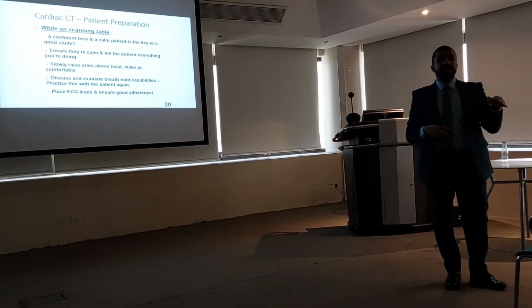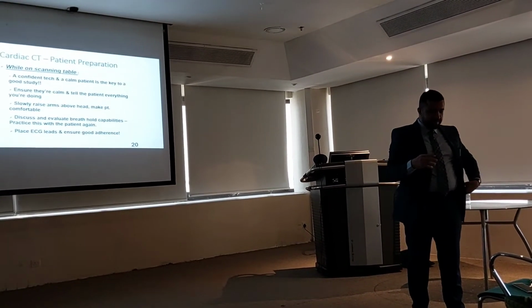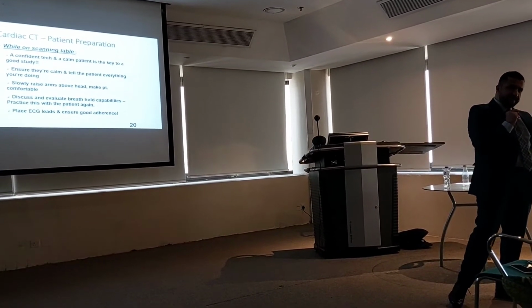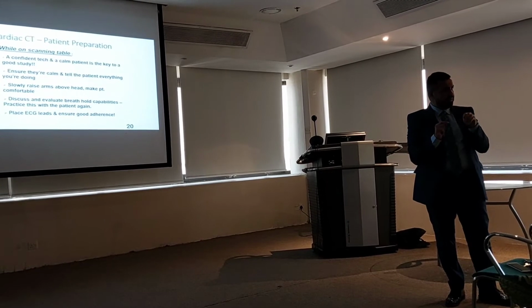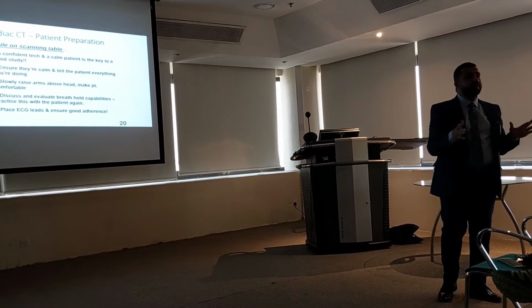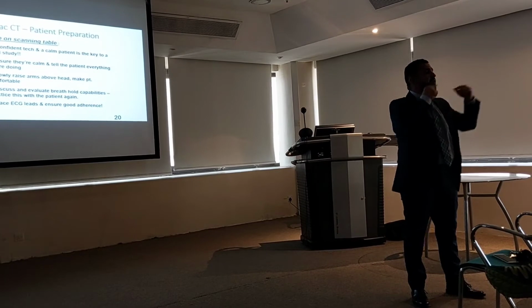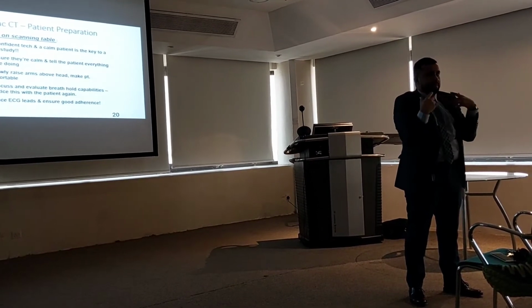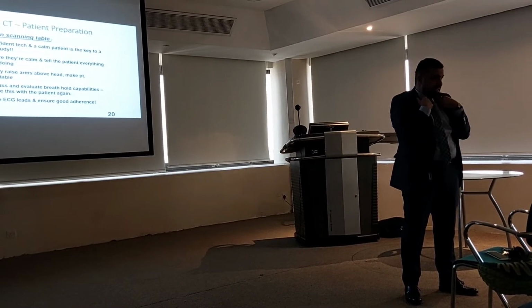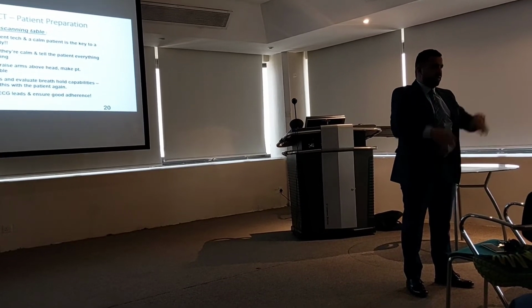Now, this really happened to me. Every time I'm getting everything almost done, and then at the last stage, I'm getting things compromised. So one of the things that really enhances the result is this: I started asking the patient to put his arms down while I'm fixing the ECG. I have to ask the patient's arms up because the ECG position of the leads is very good that way. So I will apply it while his arms are down and then up.